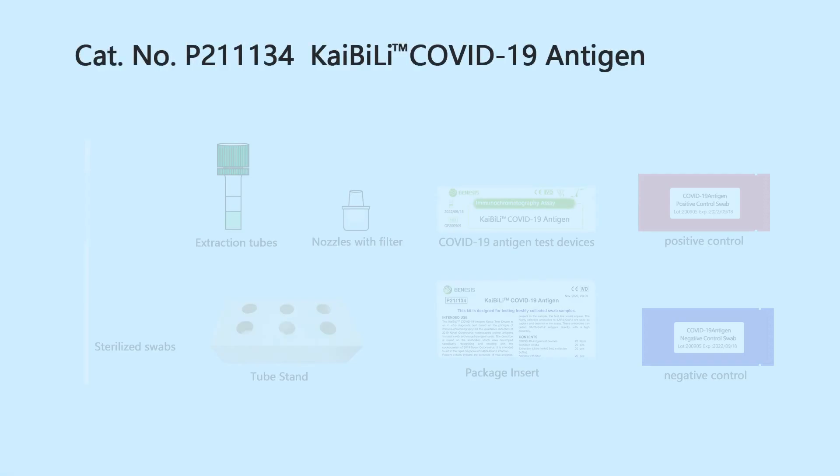The kit includes sterilized swabs, extraction tubes with 0.5 ml extraction buffer, nozzles with filter, and a tube stand.